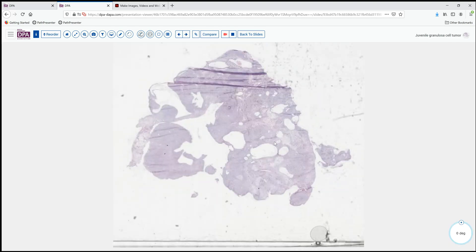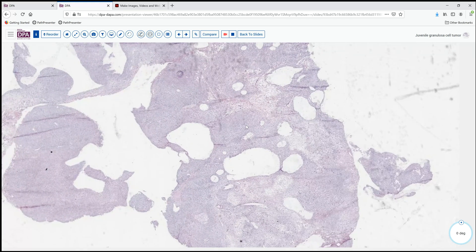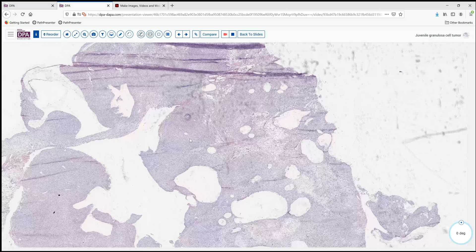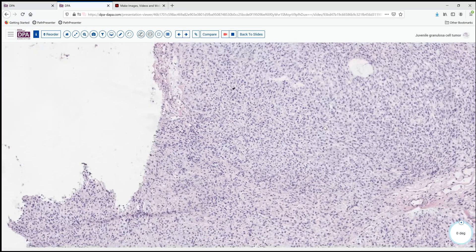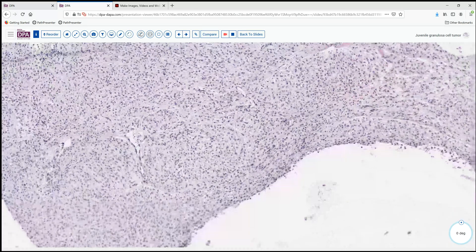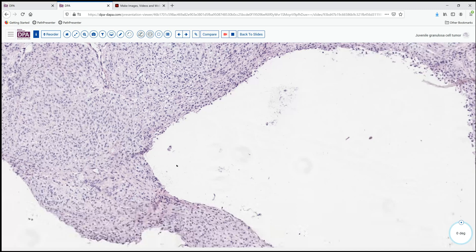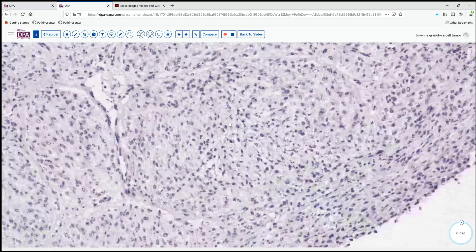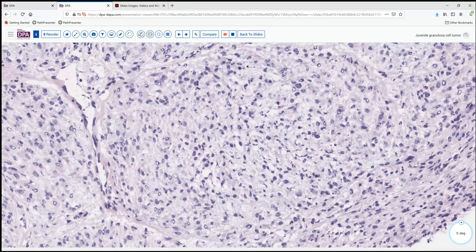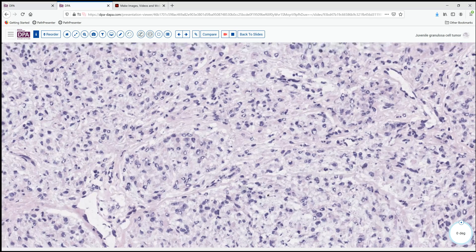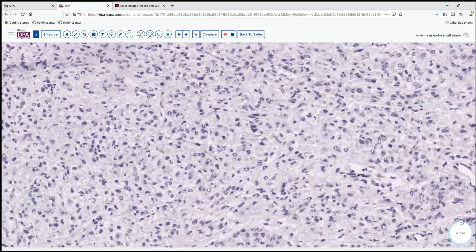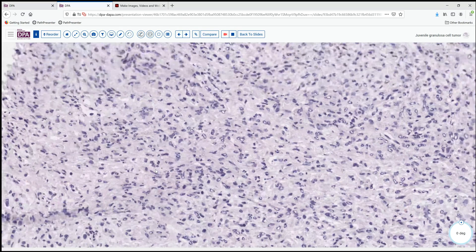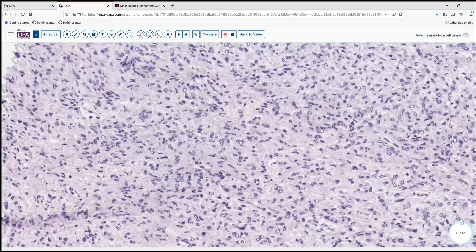A frozen section is requested to see what needs to be done with this lesion. Here we can see on frozen section that this follicular pattern is quite nicely repeated, with multiple cystic spaces and a diffuse pattern of cells in between. At higher power, these cells don't appear to be forming epithelial structures, and these follicular structures are dilated and not lined by any epithelial cells. Higher magnification shows some enlargement of the nuclei and variability here and there. We might see maybe a mitosis or two in some areas, but just a diffuse pattern of sheets of cells.